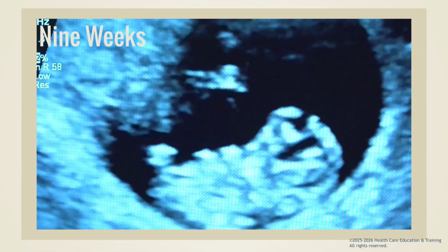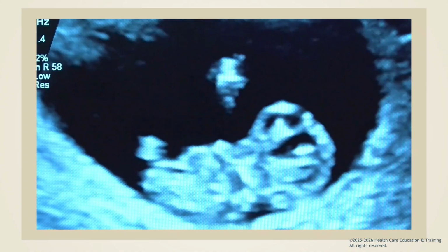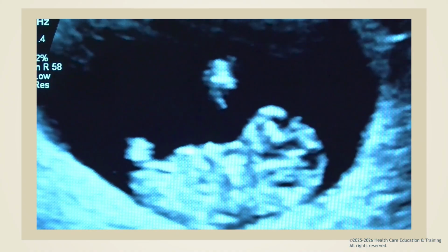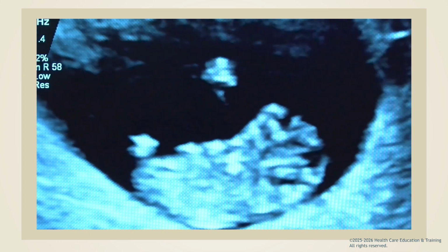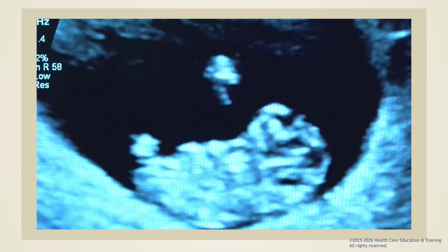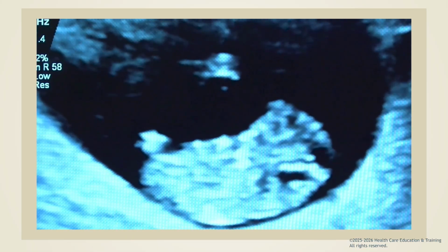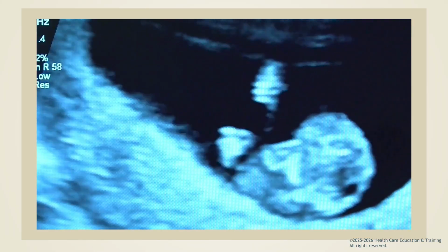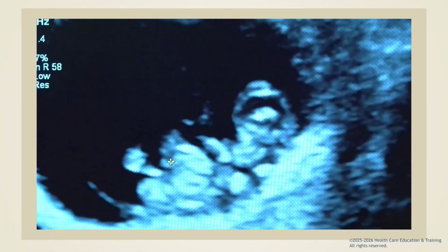We've been looking at an ultrasound of an embryo that is about 9 weeks along. At this stage, this embryo is still very small, just about the size of a grape. The part that will develop into the head looks big compared to the rest of the body, which is expected for early development. Looking closely, it may be possible to see the early form of what will become the spine. It can look like a thin, bumpy line going down the back of the embryo.